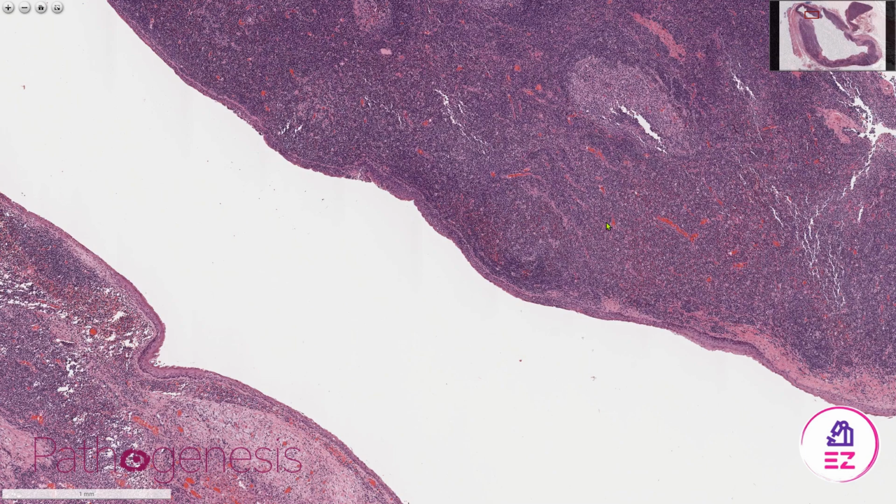For example, in oropharyngeal cancers that metastasize to the cervical lymph nodes, sometimes they're quite cystic. P16 alone isn't going to be that useful because sometimes branchial cysts stain for P16. But if they're positive for HPV on HPV PCR or ISH, then you really need to have a close look at the tonsil and oropharyngeal region to make sure they don't have a primary in that location. Because the lining isn't always that atypical, so you really do have to be cautious.